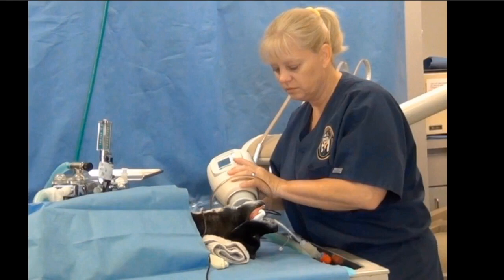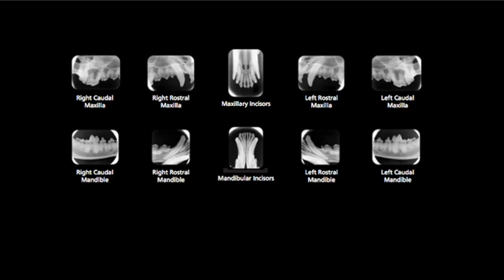That takes Annie about four minutes to go through that whole patient. So you should be taking full mouth radiographs on small dogs in eight minutes or less. If you're not, number one, you're probably not using this approach. If you are using this, you need to practice more because it's totally doable. Large dog — 15 minutes or less, more like 12. Annie's going to do this in about seven to eight minutes. And then huge dogs, 20 minutes or less. So that gives you some guidelines.